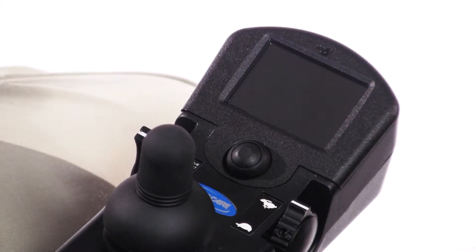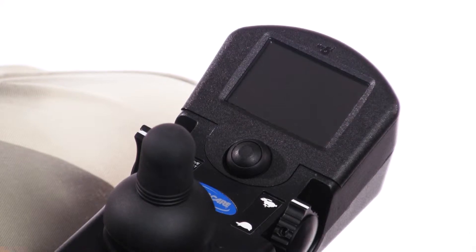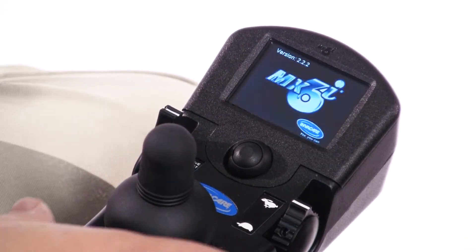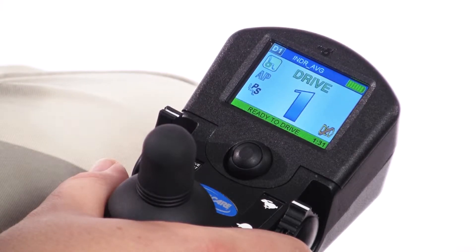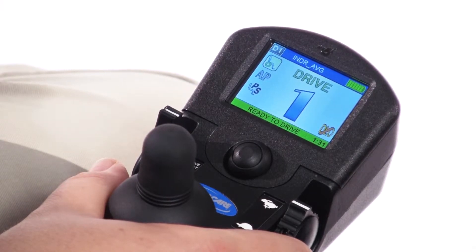One helpful but overlooked customizable value available in the Performance Adjustments menu of the Mark VI Handheld Programmer, or any programming screen, is Tremor Dampening. Although it is likely not to apply to the majority of your clients, it is a unique feature for accommodating upper extremity tremors or ataxia.